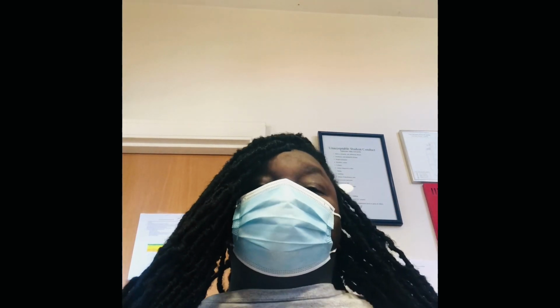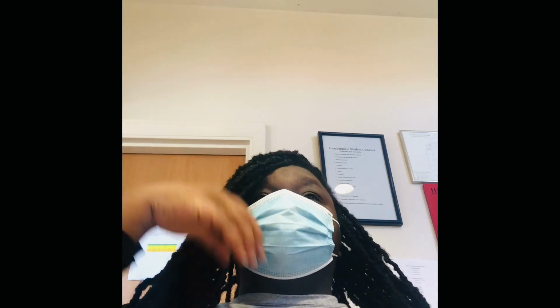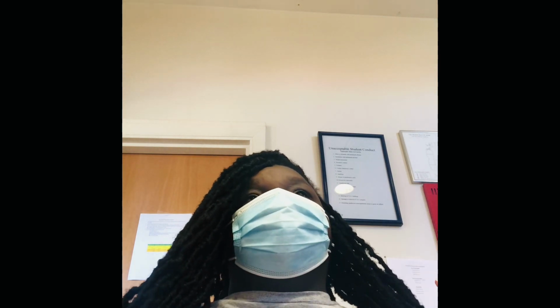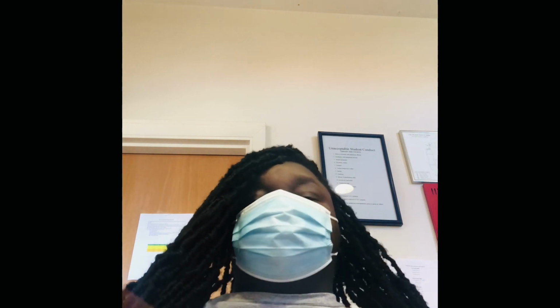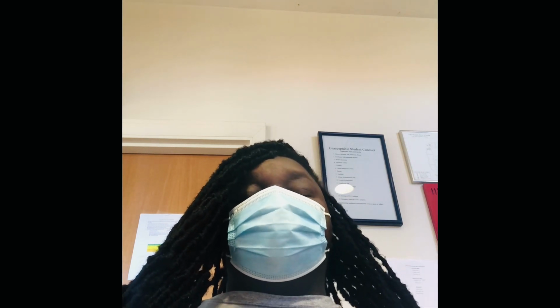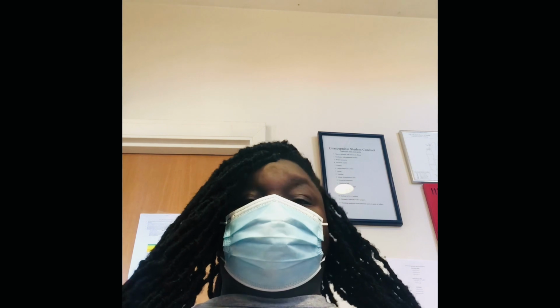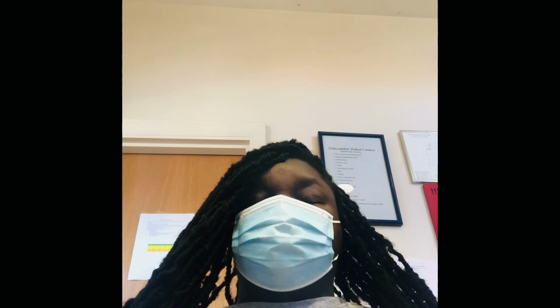You're going to make sure that the device is angled and adjusted so that you can actually get the flutter sensation within the chest. Then you're going to keep repeating this for 5 to 10 breaths, and you're going to follow that by huff coughing, which is just forcefully making themselves cough. You're going to keep coaching the patient that this is to help them remove mucus secretion from their system, but don't exceed this. Don't go past 20 minutes of doing this therapy. Allow the patient to get a break.